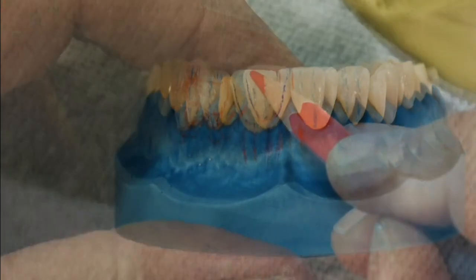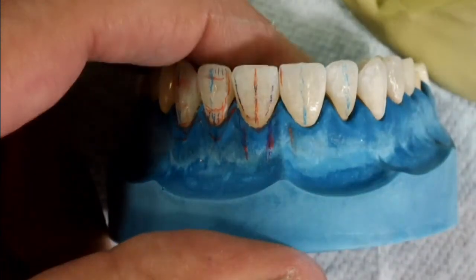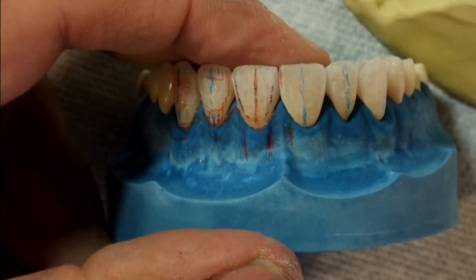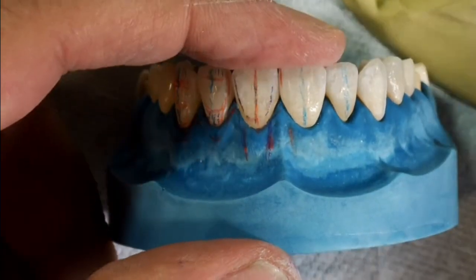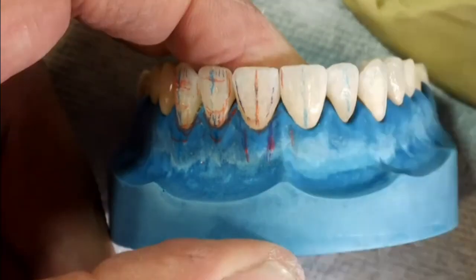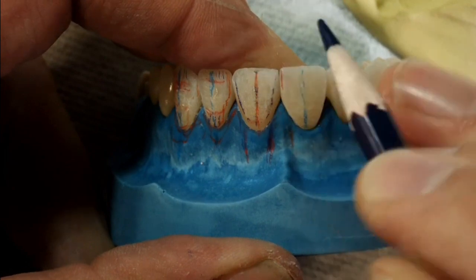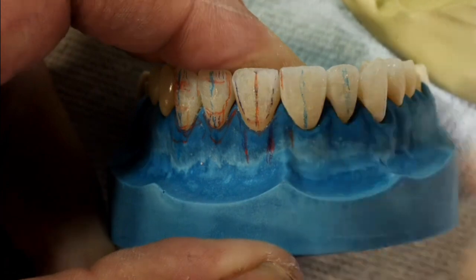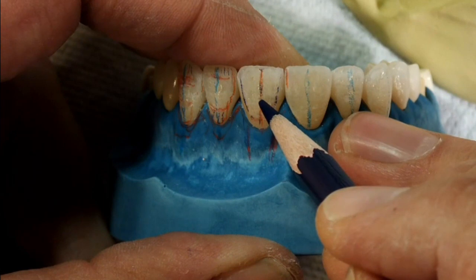Now I want to show you a simple step-by-step way to establish the primary plane. For those who don't know, by definition it is the flat plane on anterior teeth inside the mesial and distal lobes, which is in alignment with the long axis. The first step is to draw one point at the incisal edge at the long axis. The second point is at the end of the cervical one-third along the long axis.